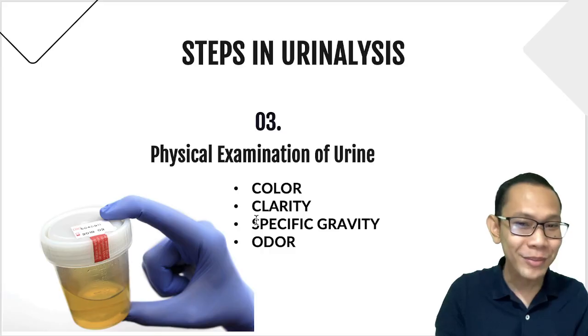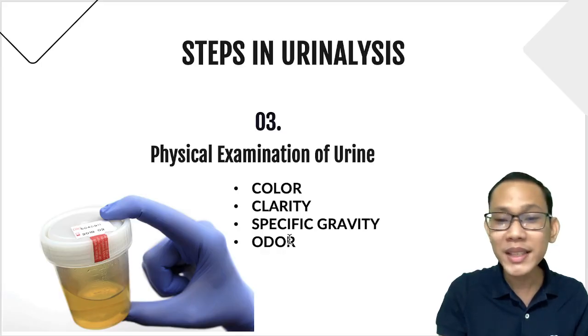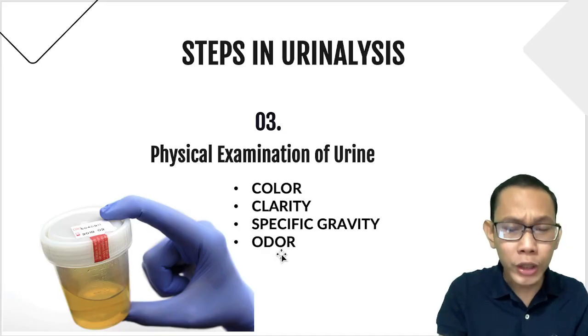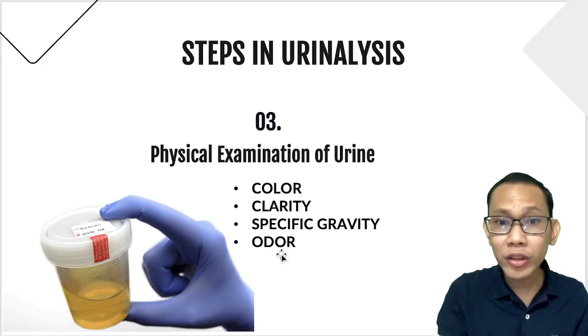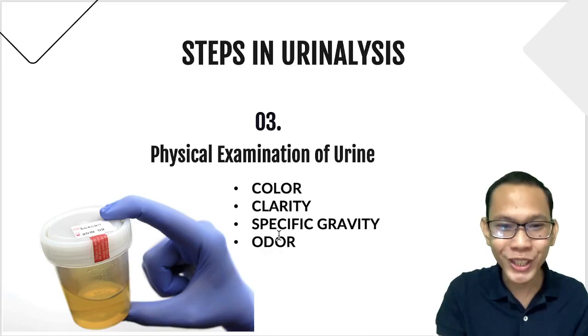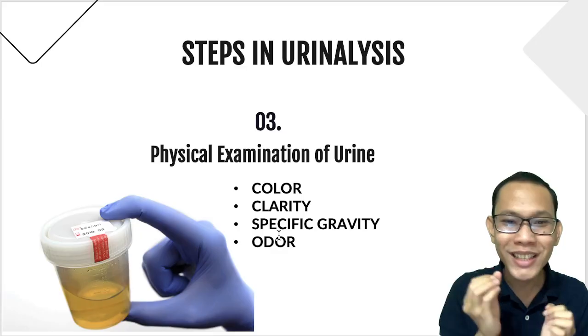Of course not, because your odor is not part of the routine physical examination. But again, it is a noticeable property. Meaning to say, your odor may also give us a hint or a clue that a possible disorder or disease is present in our patient. But this should not be part of a routine urinalysis; we don't do it. Imagine, you have your urine samples. Are you going to smell each of these samples?